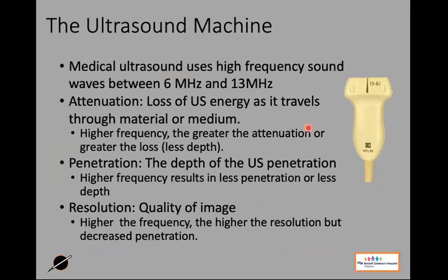There was a lecture just the other day Kevin Whitelaw did using the curvilinear probe. It uses lower frequency sound, travels deeper, and when we go lower with our frequency, we get less detail. So this probe here is the one that we like to use for ultrasound because it gives us those nice high resolution images. The downside is it doesn't go very deep, but that's okay for us because we're looking shallow in the tissue.